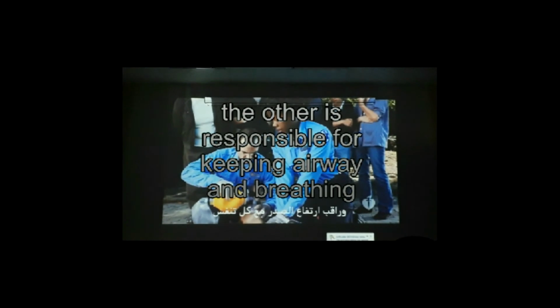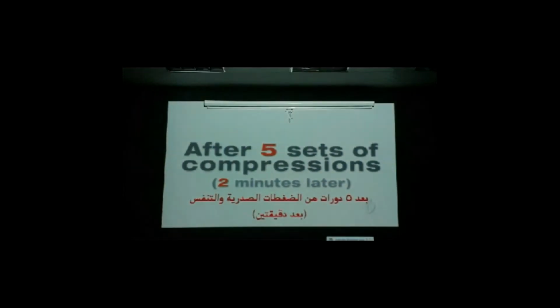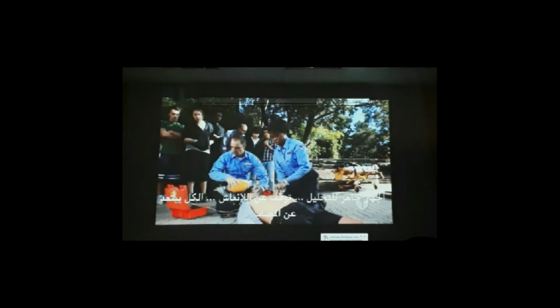1, 2, 3, 4, 5, 6, 7, 8, 9, 10, 11, 12, 13, 14, 15, 16, 17, 18, 19, 20, 21, 22, 23, 24, 25, 26, 27, 28, 29, 30. Stay clear of patient. Everybody clear? Let's switch. No shock. Keep waiting. Keep going.